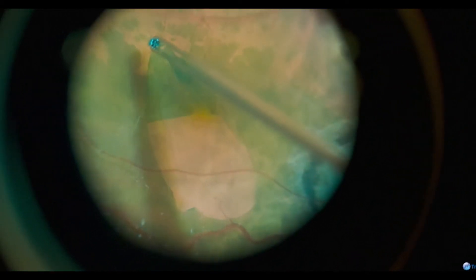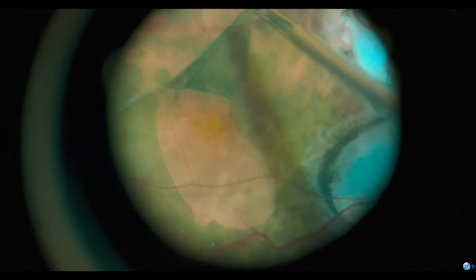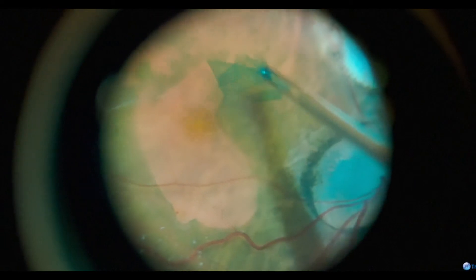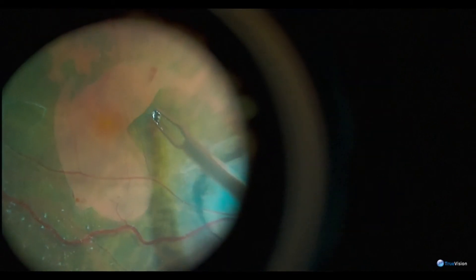We used ICG and peeled ILM throughout the macular area. You can see here there's still some vitreous presence, so there has to be a little bit of vitreous schesis there.